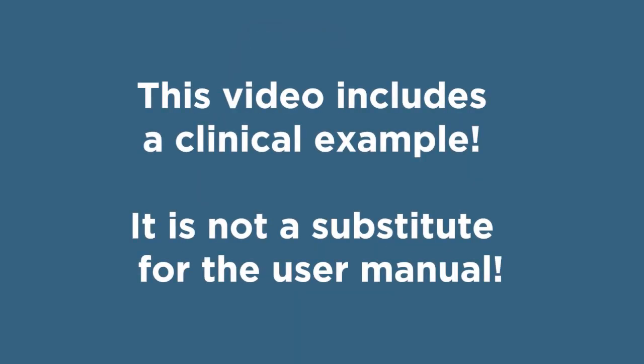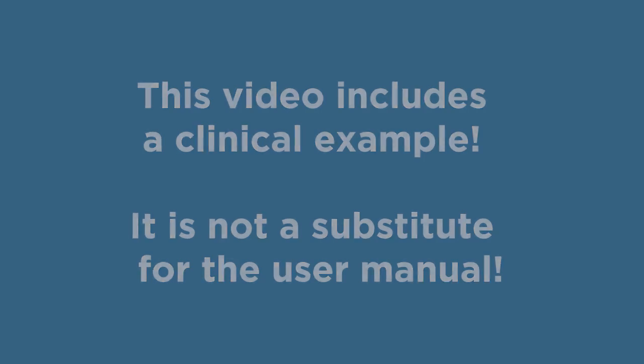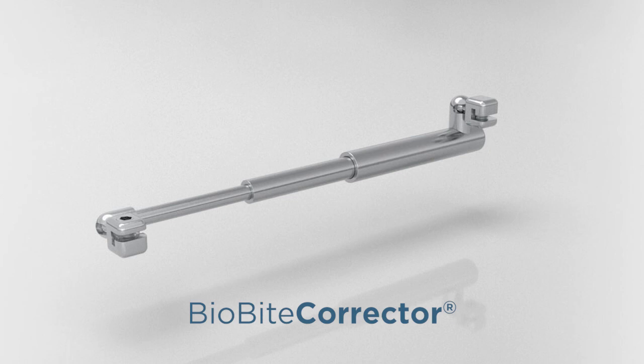This video includes a clinical example. It is not a substitute for the user manual. The BioBiteCorrector.